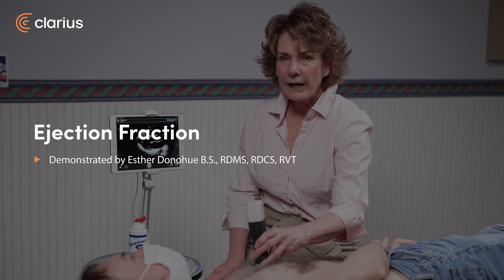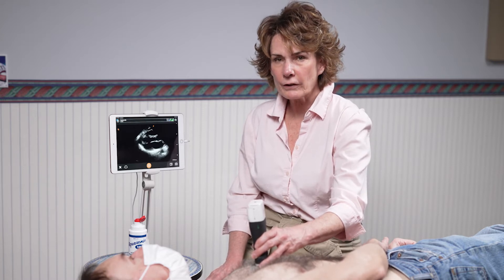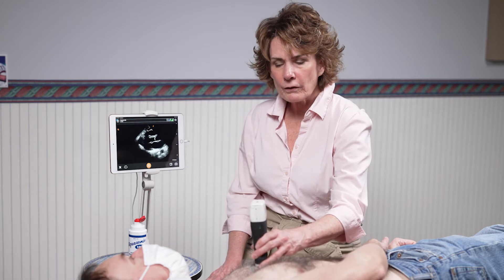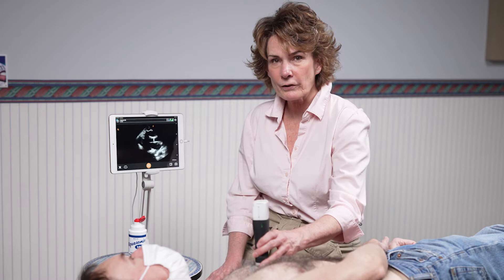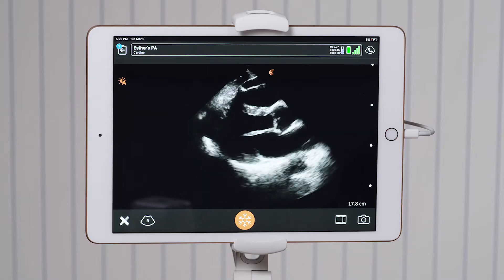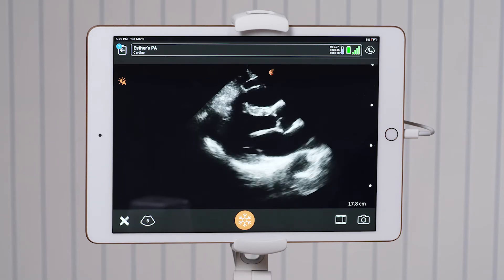Hi, my name is Esther and I'm going to be demonstrating how to do an ejection fraction using your Clarius scanner. I'm in the parasternal long axis with the indicator pointed toward the patient's right shoulder. I move between the rib spaces until I can visualize the mitral valve opening at its fullest.